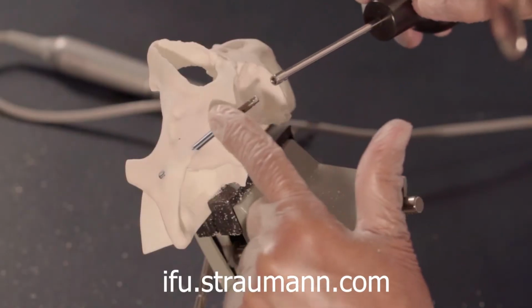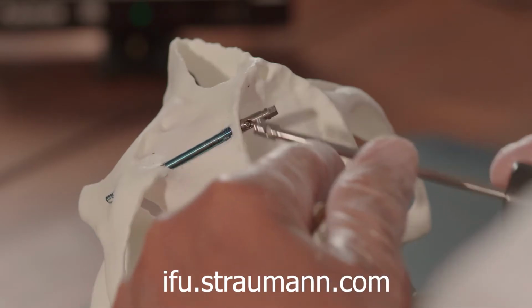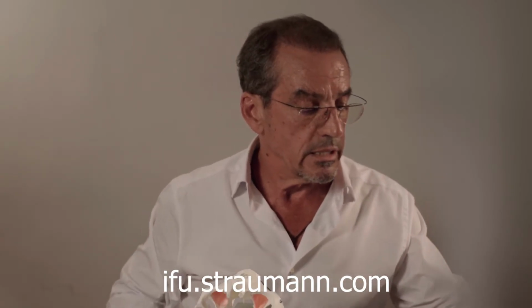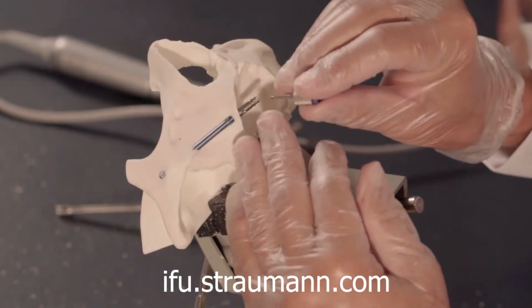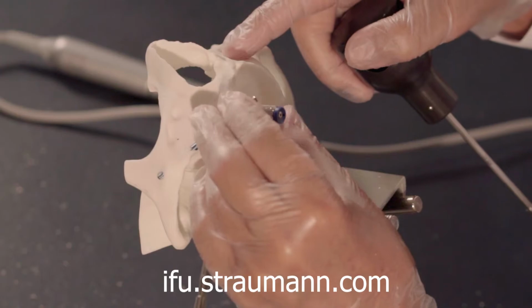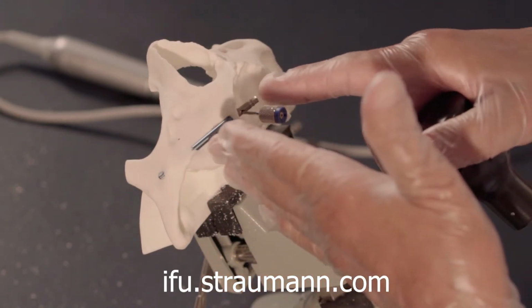So now we may see that the implant is in place and the tip of the implant is showing on the other side. Okay, so now the next step is going to be to estimate where this prosthetical screw is going to show up. You see this screwdriver is giving me the direction of the prosthetical screw.